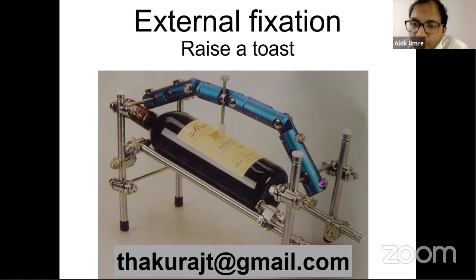Sir, how is WAC applied in case of external fixator? He is asking about how to apply WAC in association with external fixator, especially if pins are very near the surgical area. Yeah, so that requires a little planning on the part of the surgeon. When you apply it the first time, you should envisage what is going to come there.